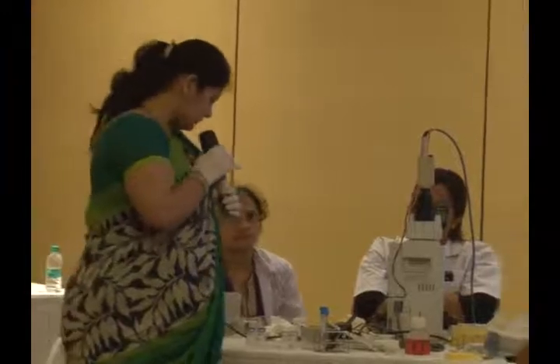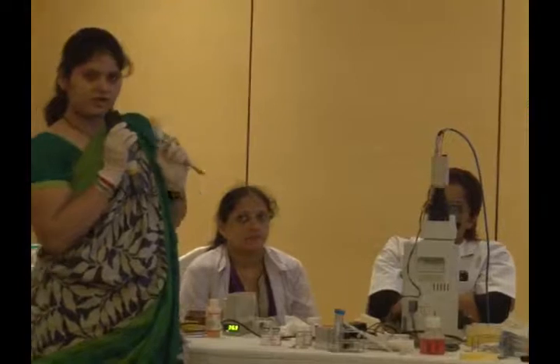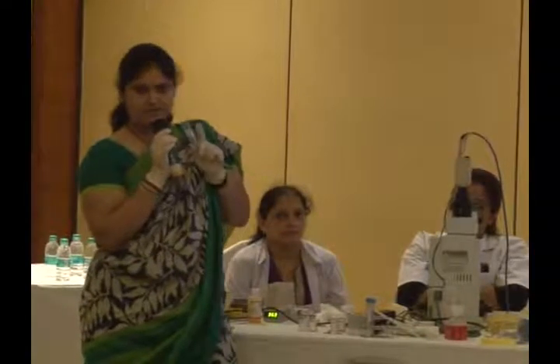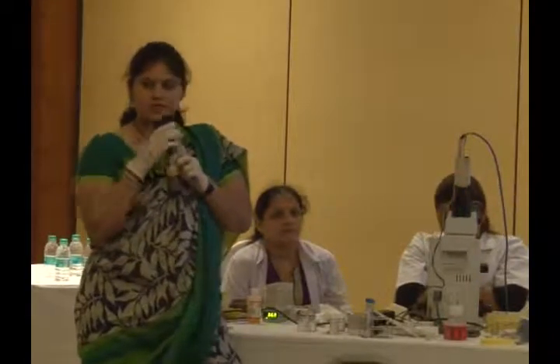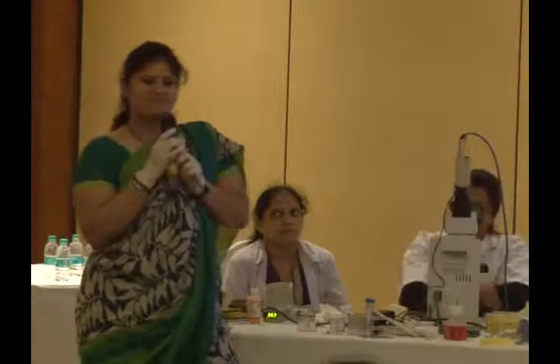Now let us start with the procedure. The very important thing is labeling. If you have 10 samples, and one more point I would like to make here: whenever you do semen processing, handle one sample at a time. There are two reasons for that. One is mismatching. If it happens by chance, then there is a big problem.